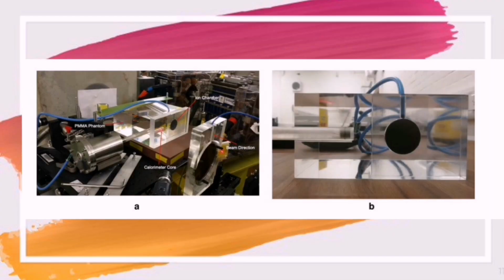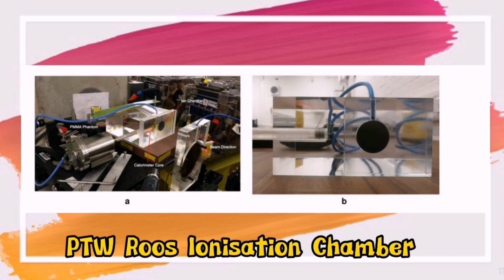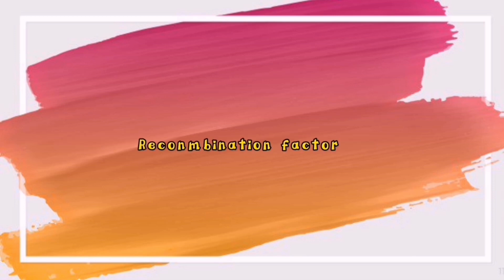The absolute dose per pulse was measured with a designed graphite calorimeter compared to dose obtained from a PTW ROOS ionization chamber.